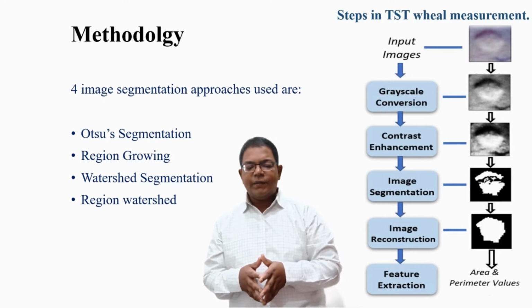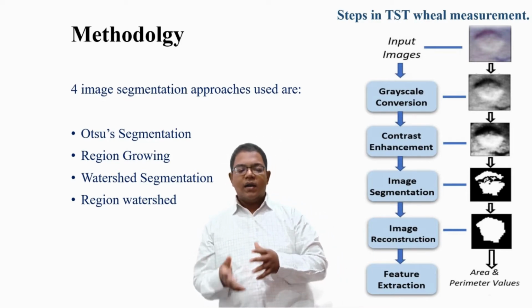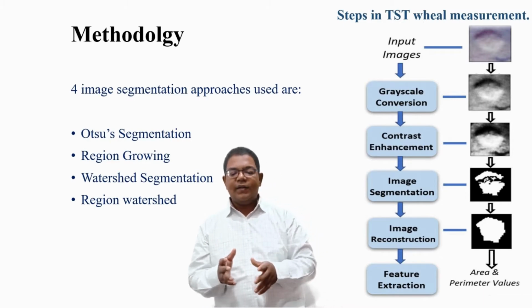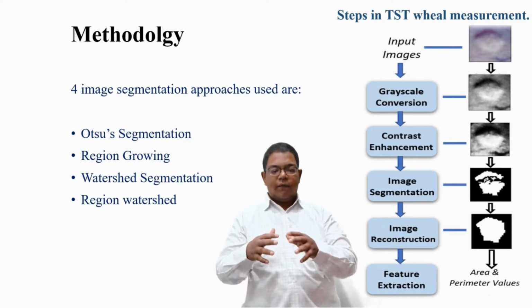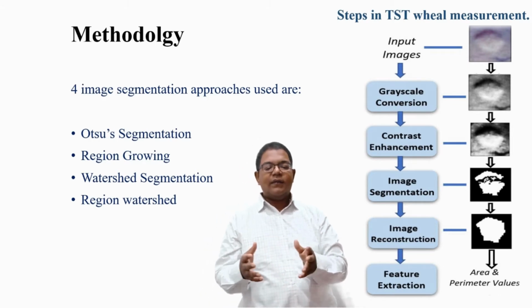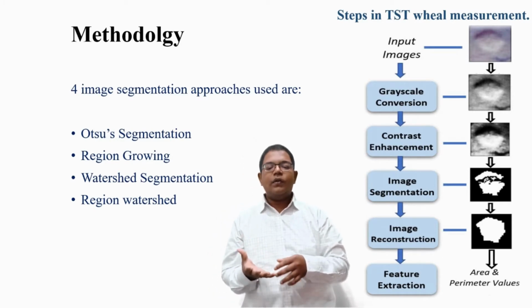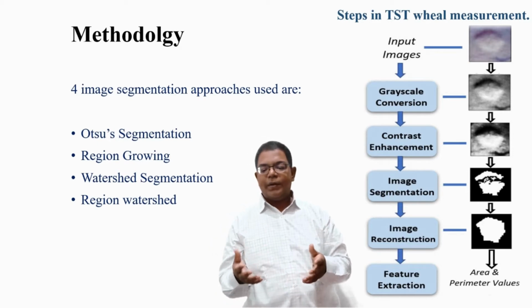After which the current pixel and the seed pixels are thresholded based on the intensity level. Next, these regions are built, examined over 4 to 8 neighboring pixels based on the intensity.